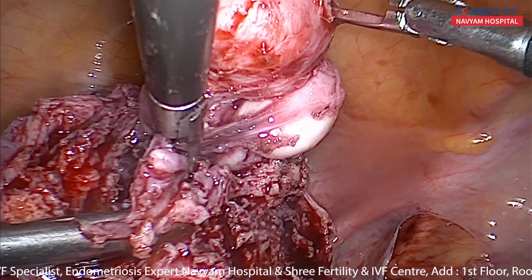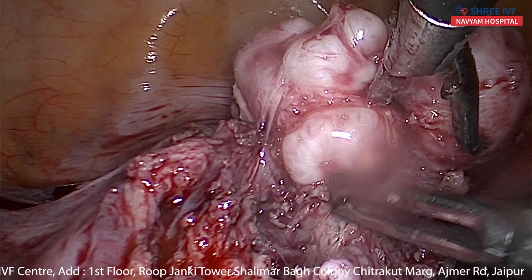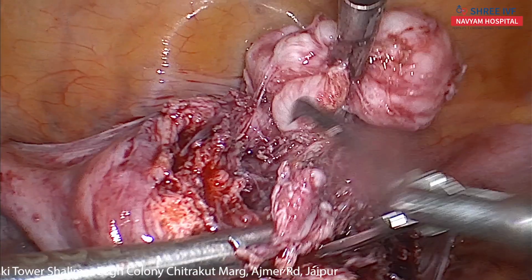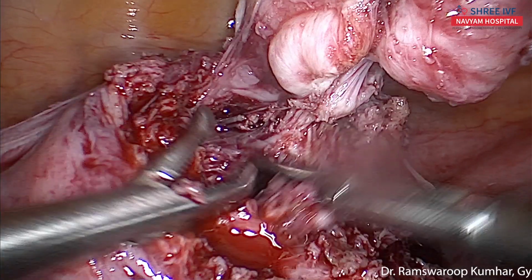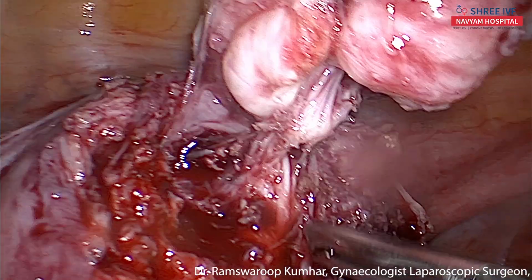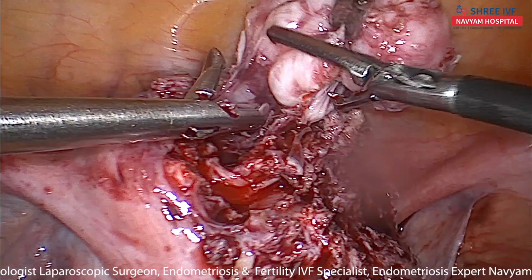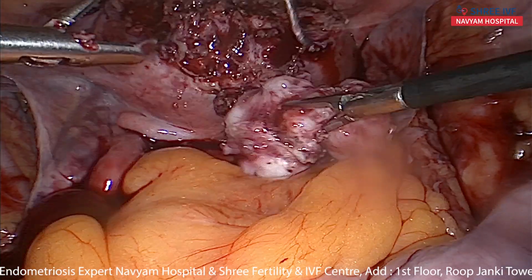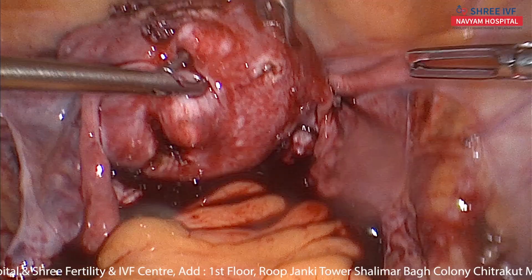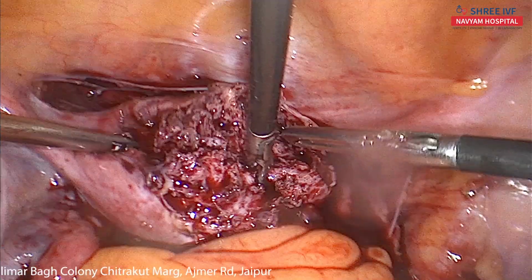Now there is no more myoma in the depth. Is another myoma or not? No, this will be cavity. Specimen number 6, 7, 6. Yeah. Okay.